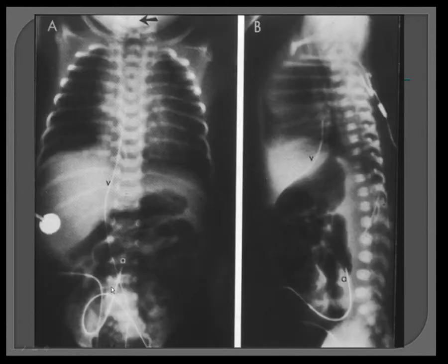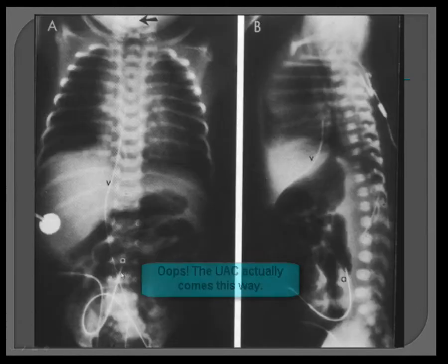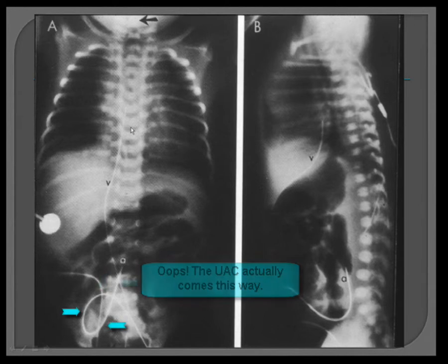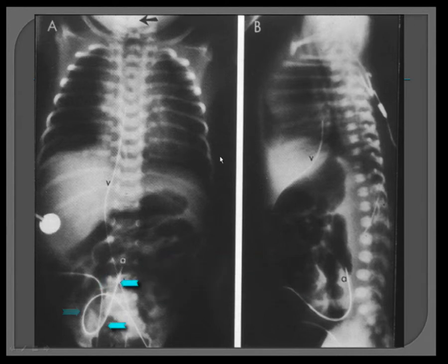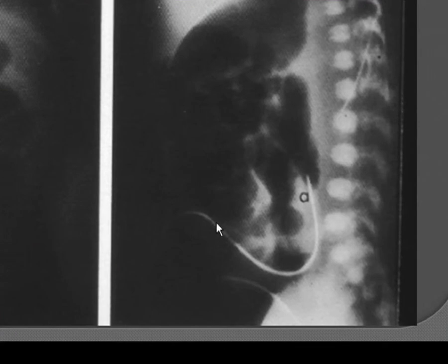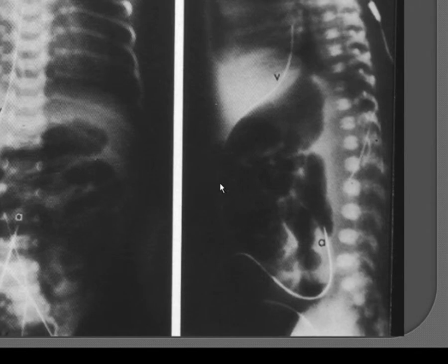Here is an older picture but a really great diagram because you can see the characteristic turn on this AP view. On the lateral view you can see that the UAC takes a more posterior course than the UVC. And this is a low line.